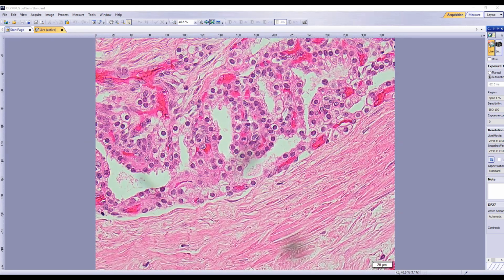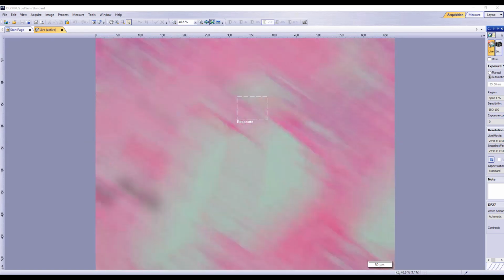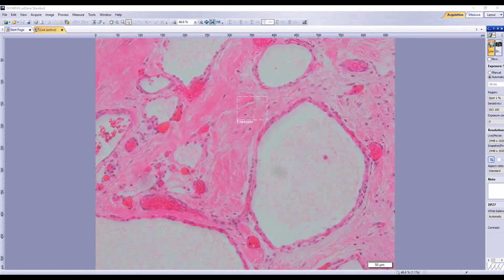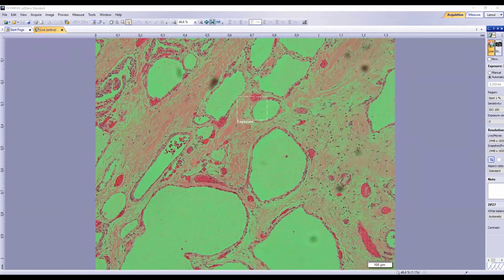The two major things that we can think of in pancreas are mucinous cysts and non-mucinous cysts. In the mucinous cysts, we have mucinous cystic neoplasm and IPMN, intraductal papillary mucinous neoplasm. Once we exclude mucinous, we have the non-mucinous cysts. What's one of the more common non-mucinous cysts? Is it a retention cyst? No, retention cyst is just dilatation of the pancreatic duct.